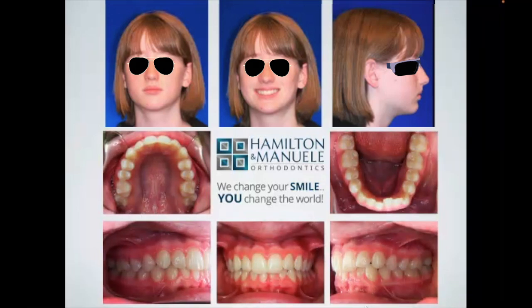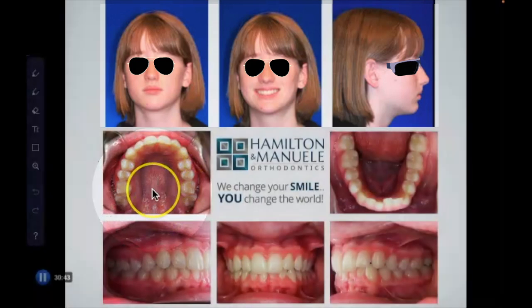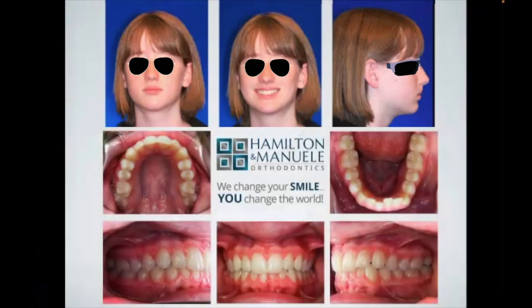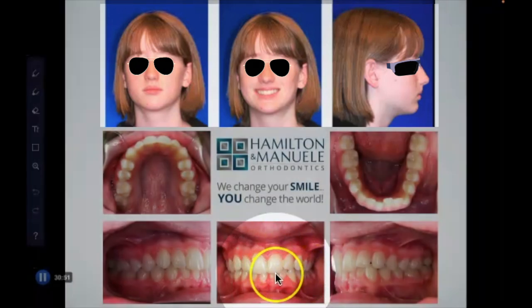This is post-expansion, post all the rest of the teeth coming in. Also a pretty decent situation, right? We've made room. The palate is still a little bit more vaulted, but definitely not as much as it was. Buccal corridors, much more full. And again, the bite is a little bit deep, not as deep as it was.